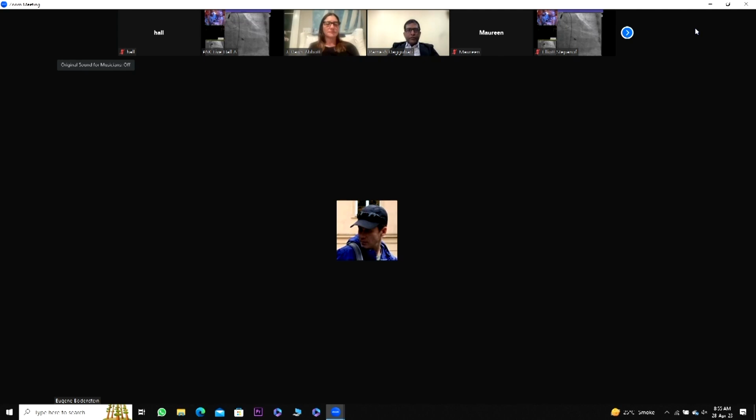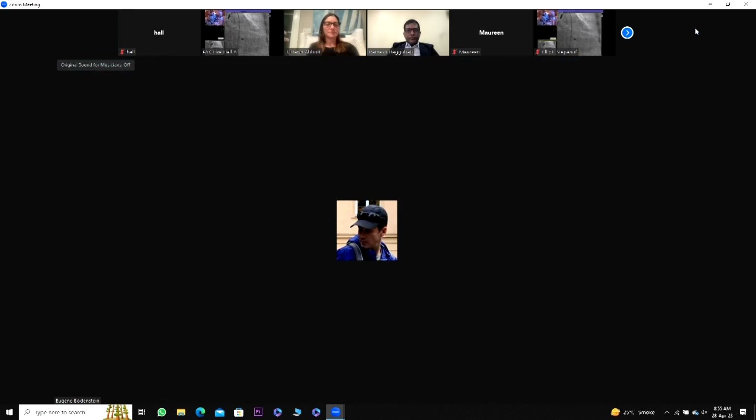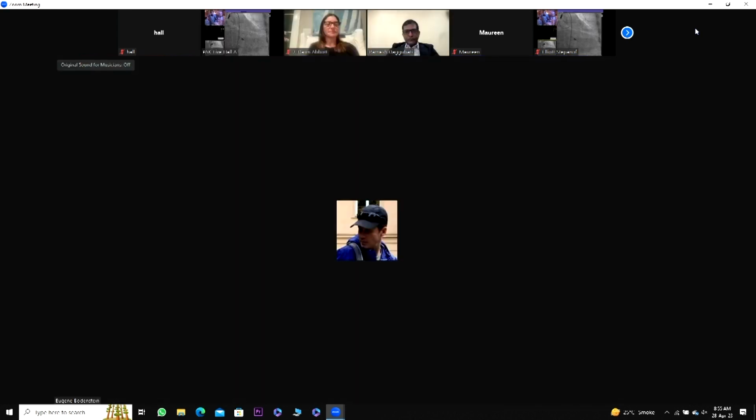Right. So I'll take a fresh 3.5 by 15 NC, please. Personally, I usually prefer to use a non-hydrophilic wire to recross the side branch. So for this case, 3.5 and 3.0? All right, Xiaomi, 3.5 and 3.0. For this case, Xiaomi, I believe you rewire from the proximal cell into the side branch. Amazing technique. Would you like to crush with a larger balloon? I think what we'll do is a POT balloon.